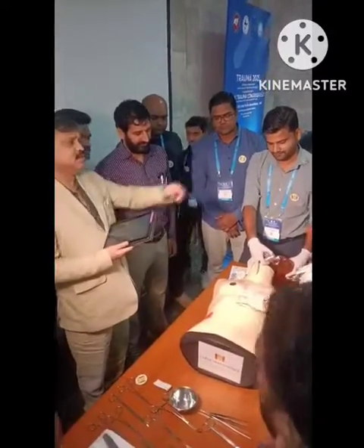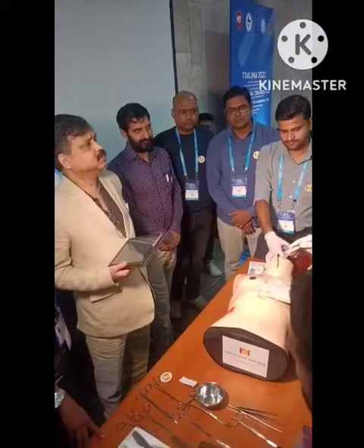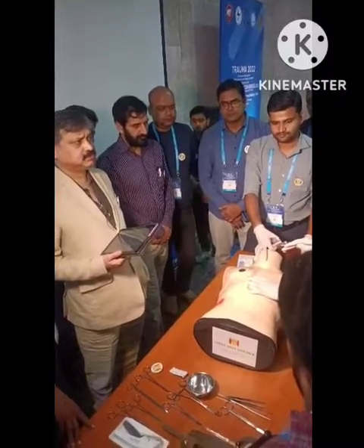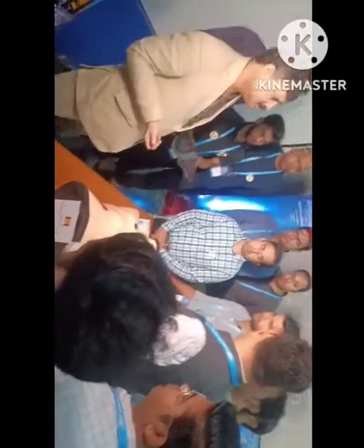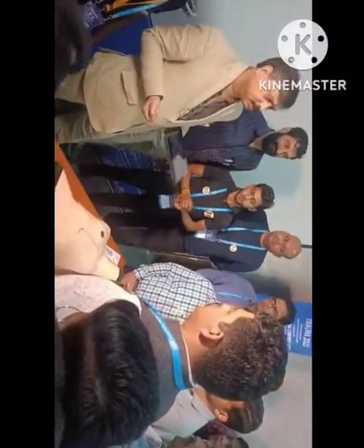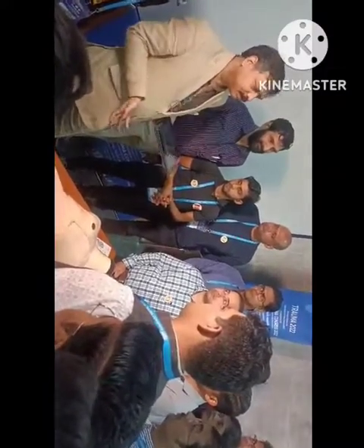So we are doing this resuscitative thoracotomy. Which one? There are two. Which one are you doing? Clamshell or anterior-lateral? I'm going for left side anterior-lateral. What do you call it? AL? So we'll show you the video. Okay. No pulse reaction, no palpable pulse, but there is PEA. Is PEA also a sign, an indication for incision? No. In traumatic cardiac arrest, forget about it, because the heart is empty.